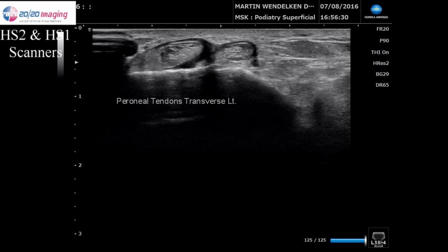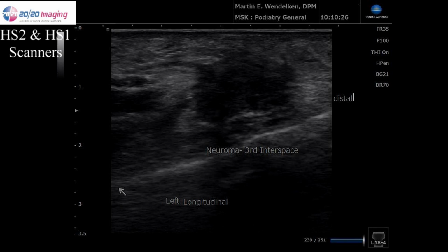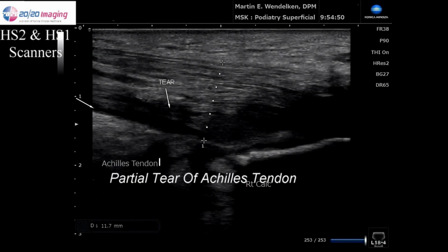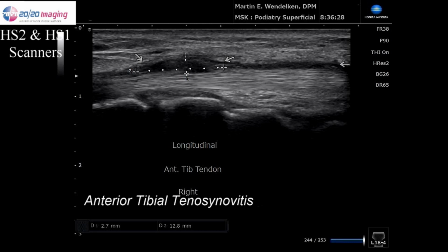This next image is that of a neuroma in the long axis. Yes, that dark hypo to anechoic structure. Okay, the next structure is now a partial tear of the Achilles tendon, which you can see it's labeled where the arrow is. This next picture is a picture of a plantar plate tear of the second metatarsophalangeal joint. This next picture is a tenosynovitis of the anterior tibial tendon.